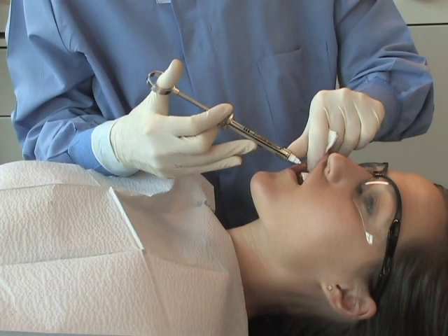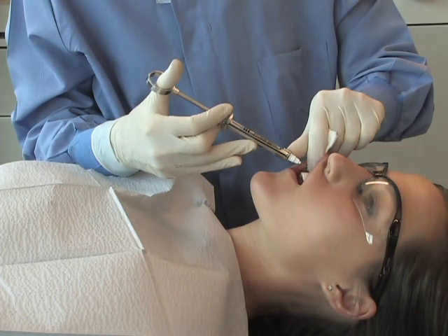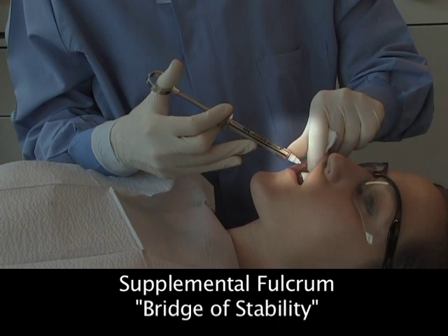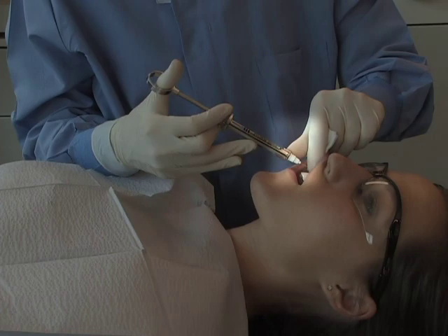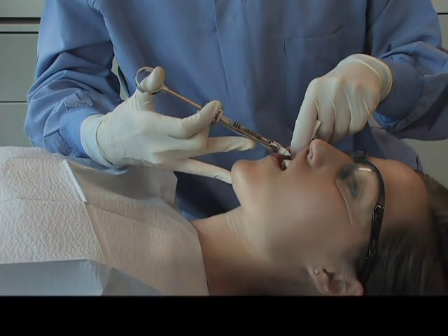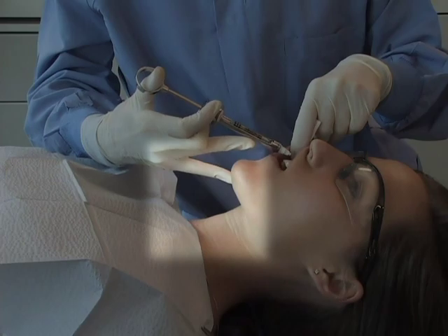Another method to increase stability, particularly in the anterior region where clinicians tend to have less stability because there are no surrounding tissues to help support the syringe, is as follows. The thumb of the non-dominant retraction hand is placed against the barrel of the syringe or a finger of the dominant hand to create a bridge of stability. A finger of the dominant hand can also be placed on the patient's chin along with the palm-up grasp position to provide stability.